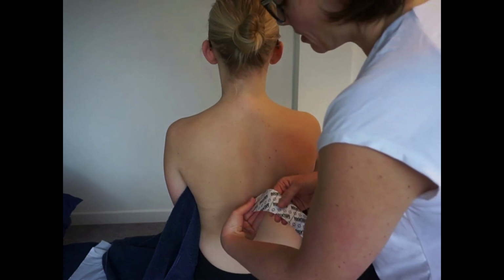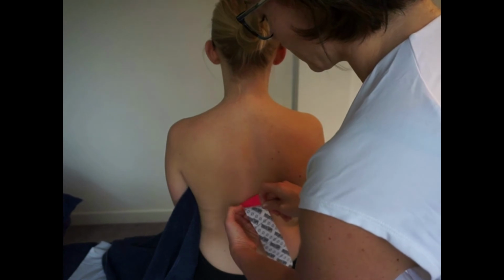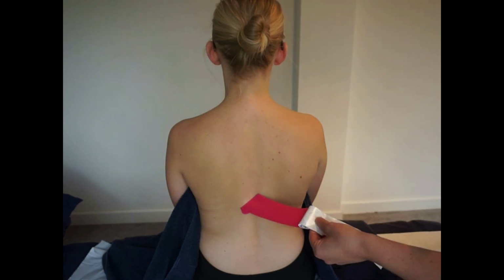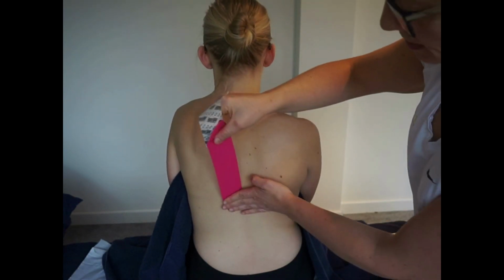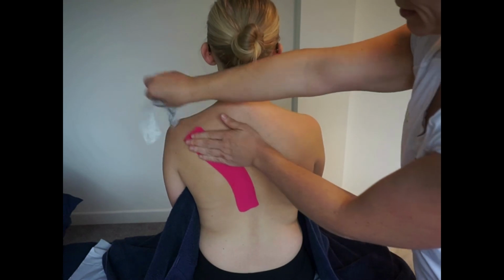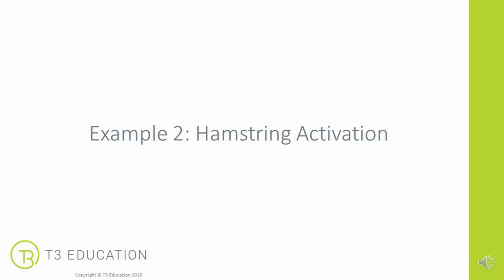Activation, so our intention here is to shorten, engage that lower trapezius. So we're going to anchor around the T12 point with no tension on the anchor. We're going to peel our tape back, and this time we're going to add some light tension or stretch to the tape and get your client to stretch that scapula away. Rub it down well to adhere it. Relax the client, no tension on the tape as we anchor the end.